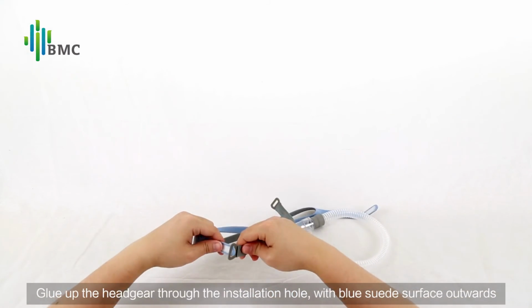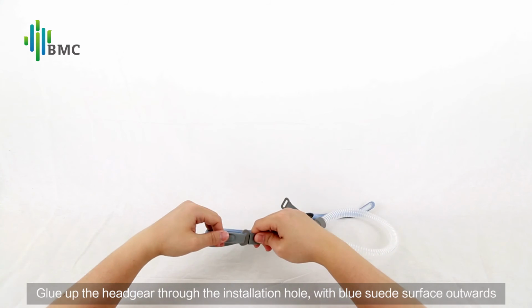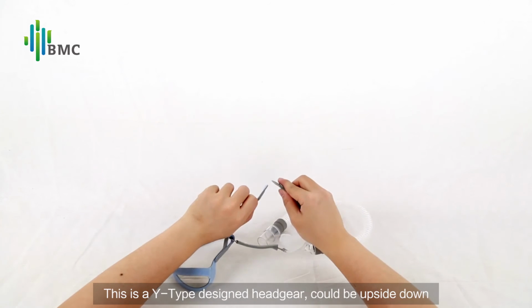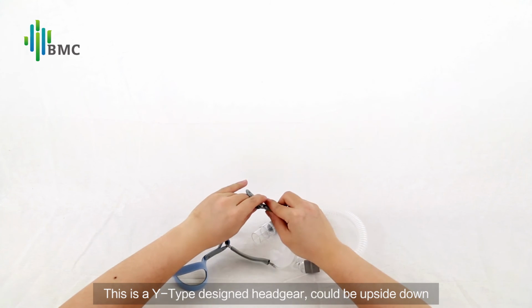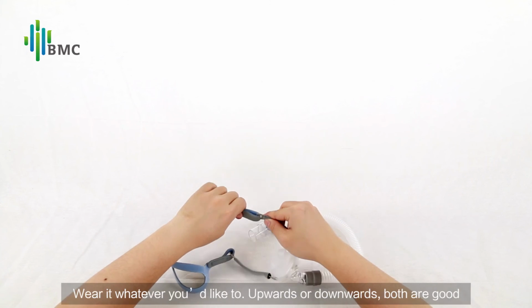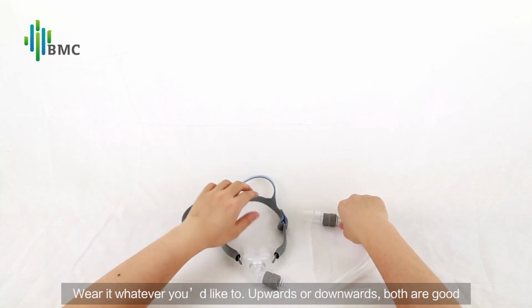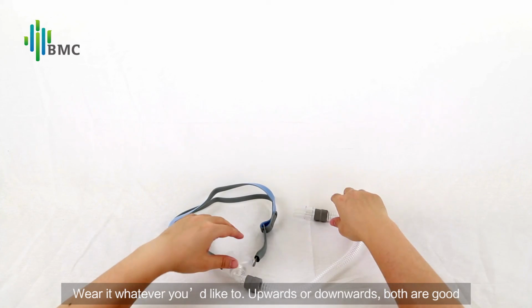Thread the headgear through the installation hole with blue suede surface outwards. This is a Y-type design headgear. It could be upside down. Wear it whatever way you'd like to, upwards or downwards. Both are good.